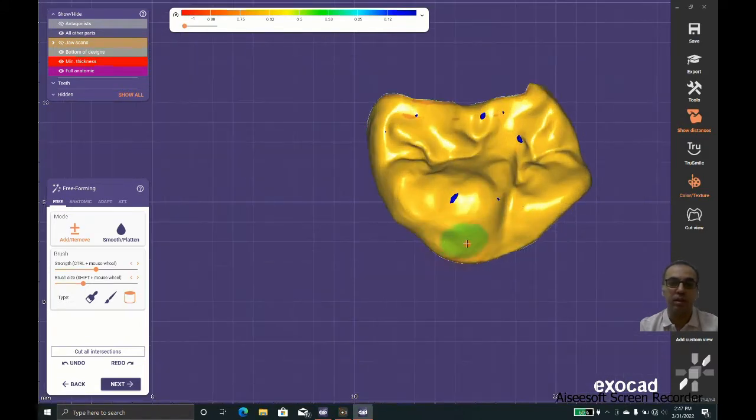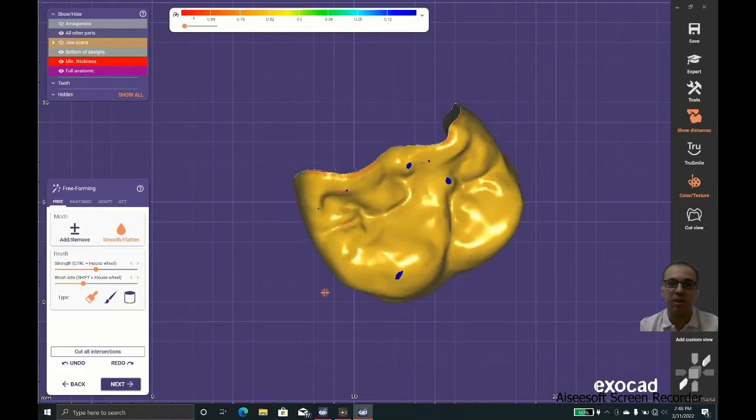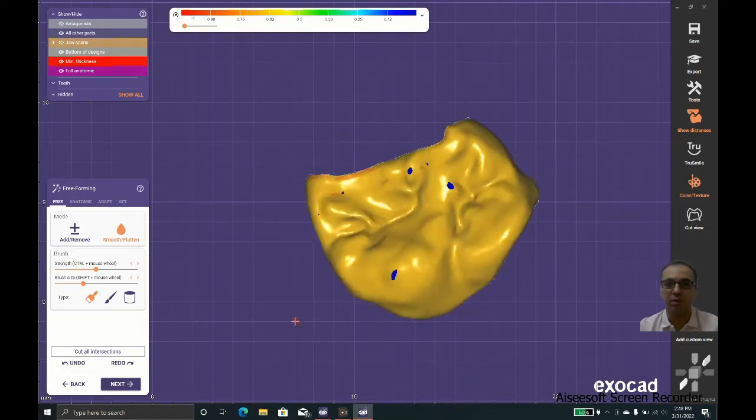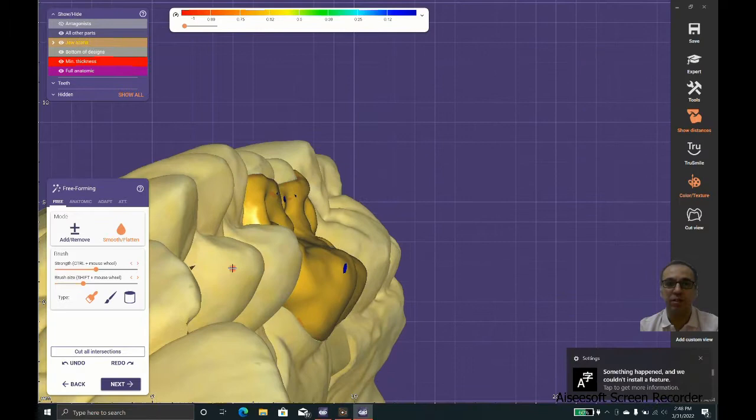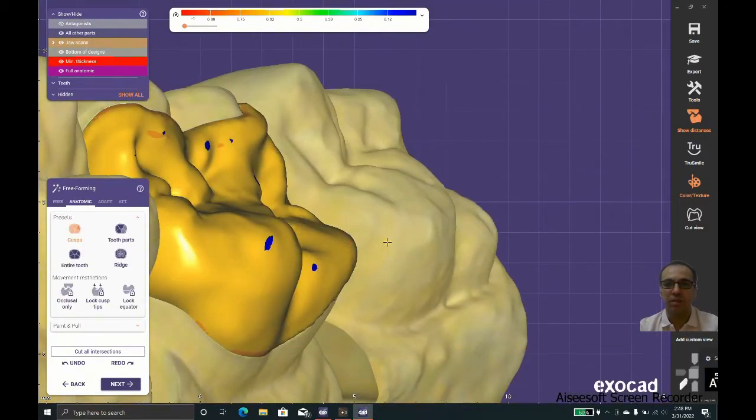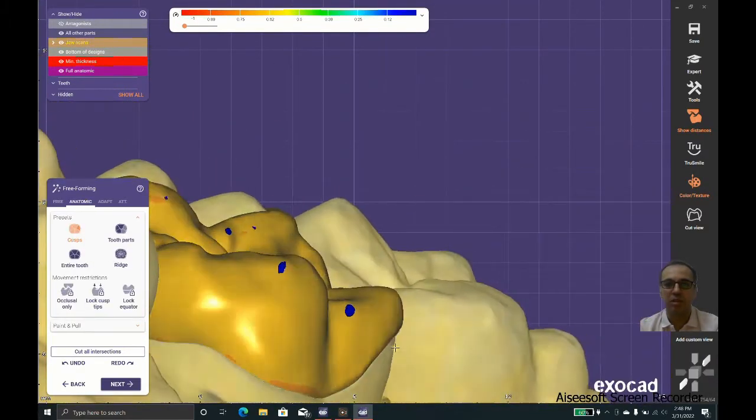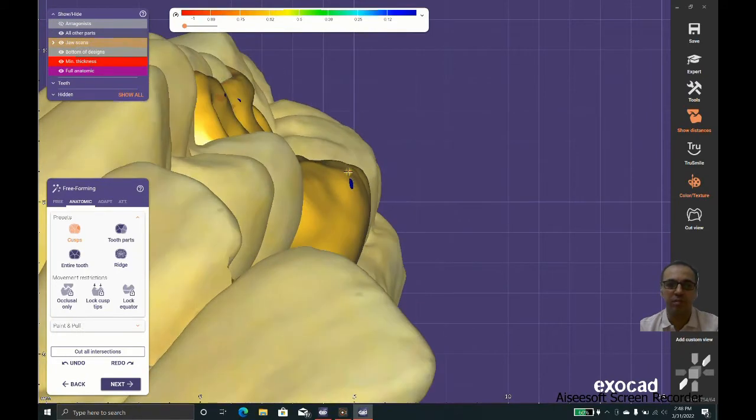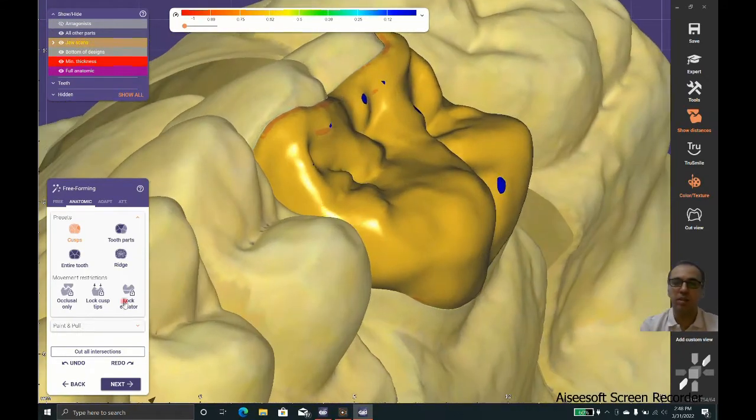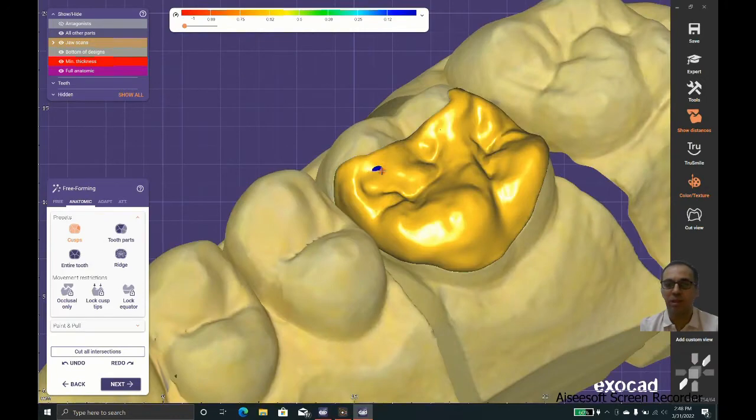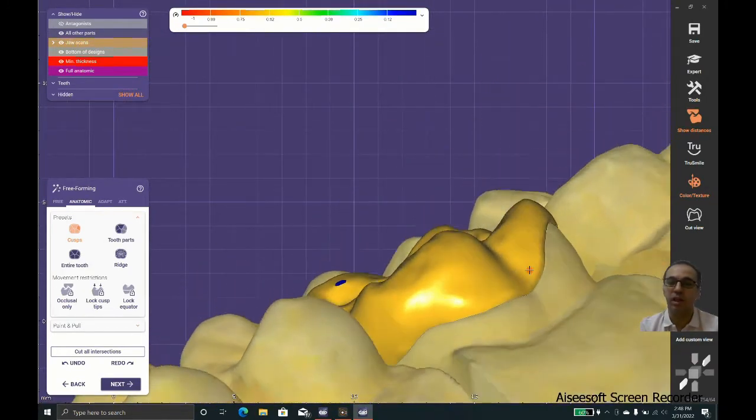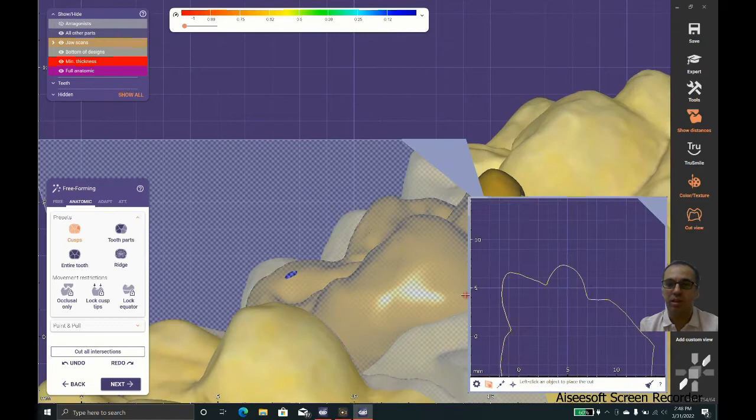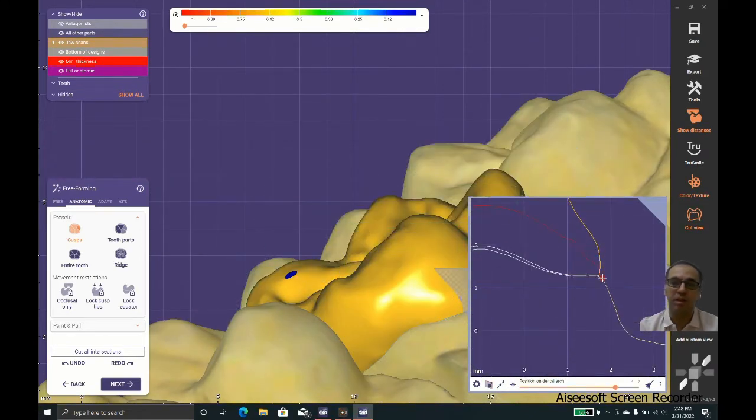As you can see, the software needs some kind of free forming. It doesn't give you completely satisfactory results, but with some small tweaks you will get good restorations. We are taking care of the curve of Spee and curve of Wilson, and we have a good emergence profile.